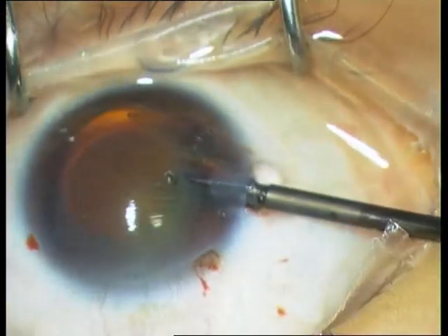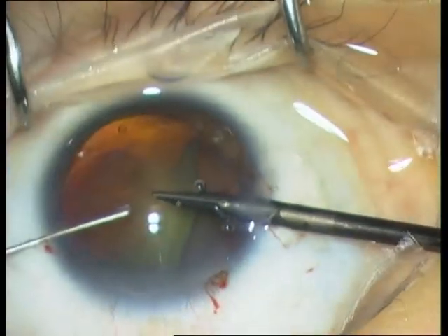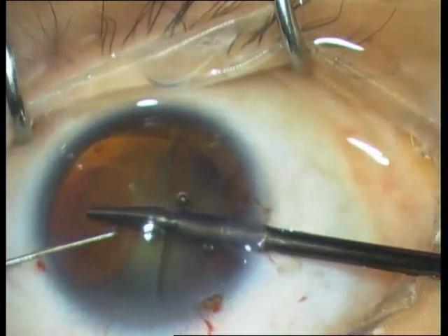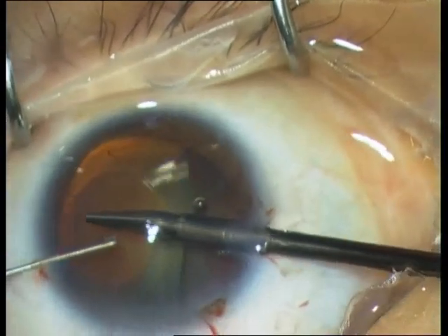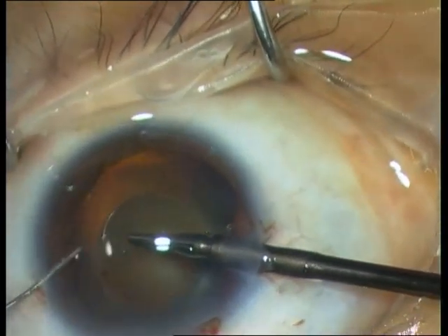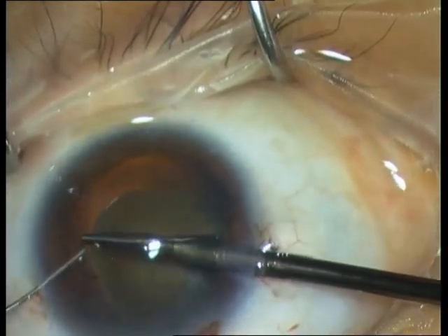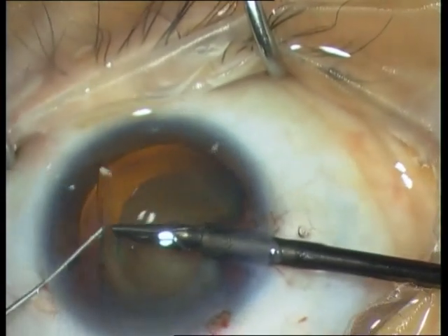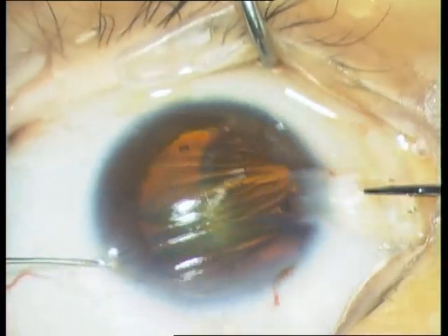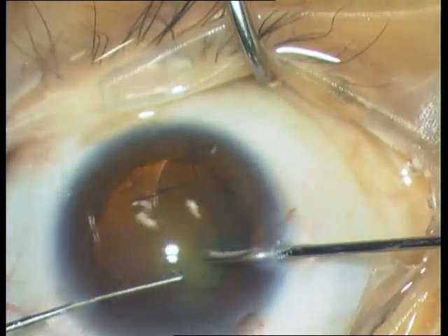So this ICL is placed on the nucleus. So we have to remove this ICL. You can cut it in two, even better in 3 pieces, and remove it then with a forceps. I'm using here scissors from Medin-Ural, Russia, Yekaterinburg, a very nice company. So now I'm cutting this ICL in 2 pieces and removing it with a serrated jaws forceps.